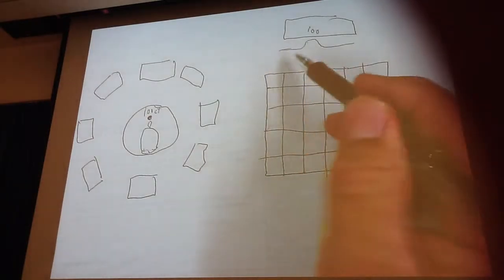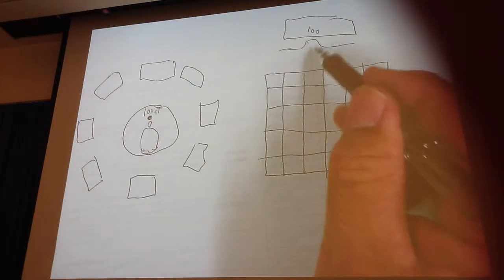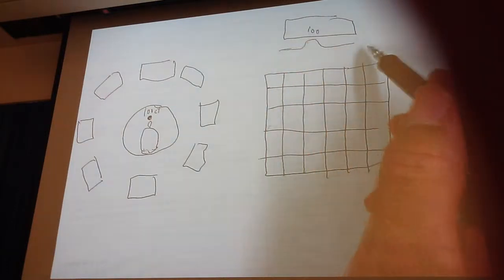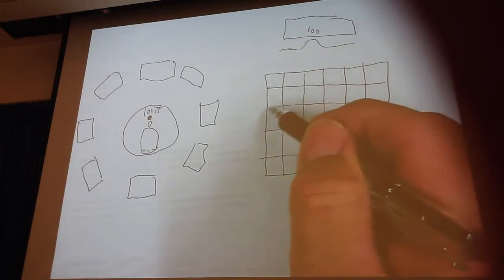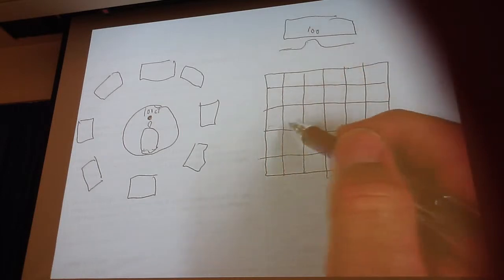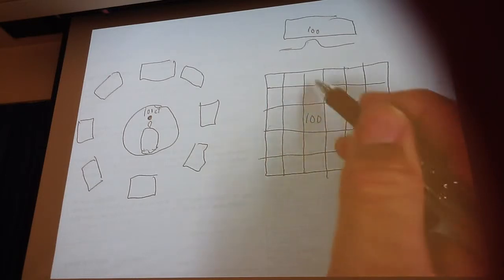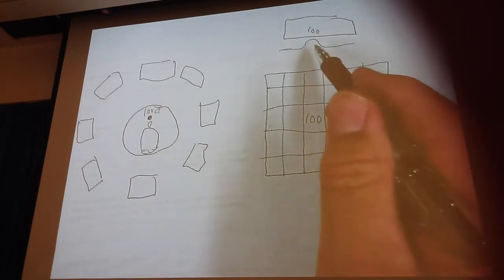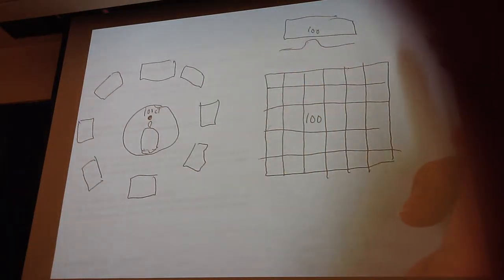Okay? There's no activity. Remember what we call this line that I'm drawing up here? What would we call that line? Fourier transform. Okay, it's a Fourier transform. It's also a profile slice. So basically what it's telling me is the detector located a source of radiation somewhere in this row. That's exactly what it's looking for. Now the problem is, where in that row did it occur?